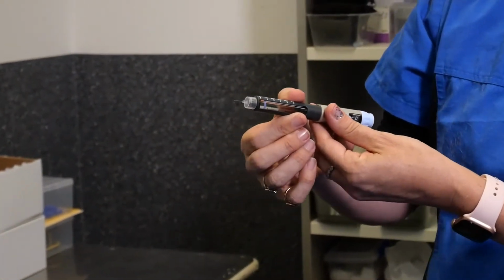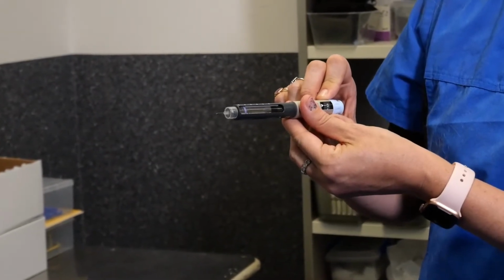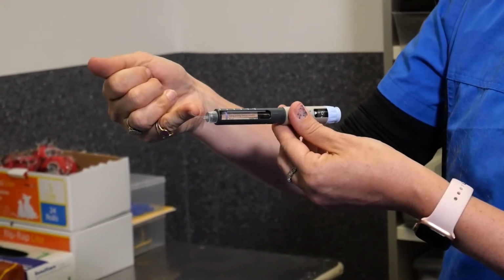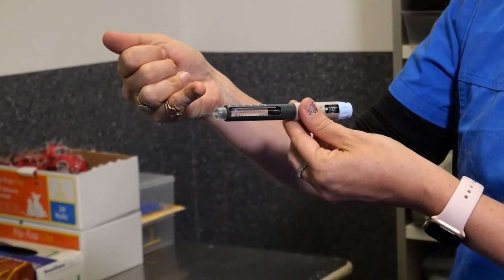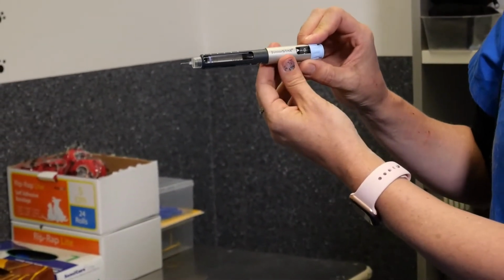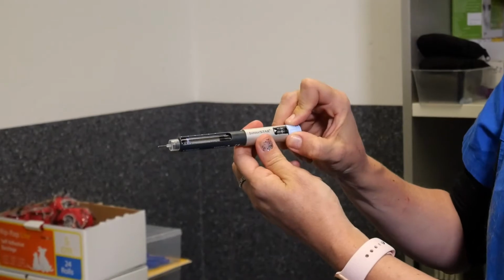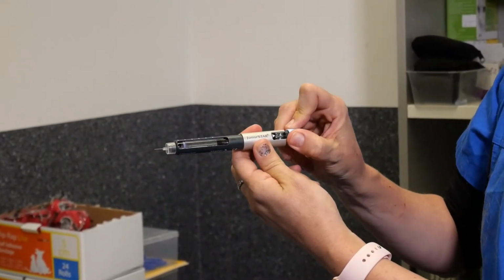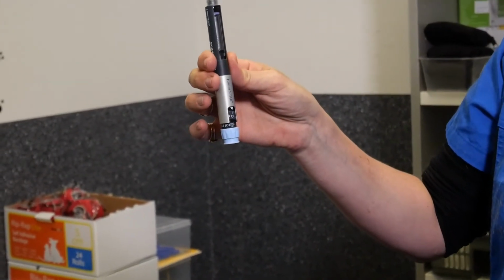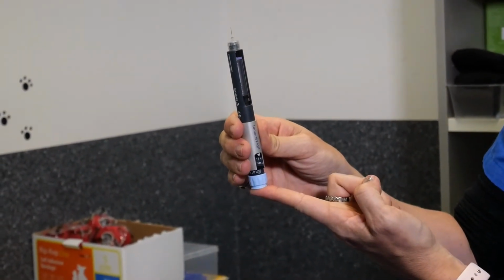Firstly, and we need to do this every time you give your cat their insulin, you need to prime the pen. What this does is make sure that there is insulin sitting within the needle, so it's not an empty needle. This is really important when we're using such tiny dosages in cats. As you can see here, you have a little dosage window, and to prime, we're going to go to 5 units of insulin. We hold the needle upright, or the syringe upright, like this and depress the plunger.